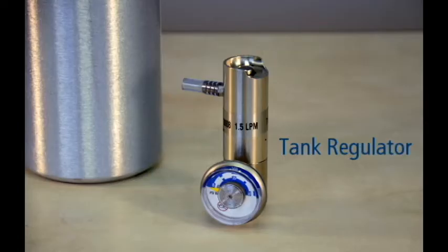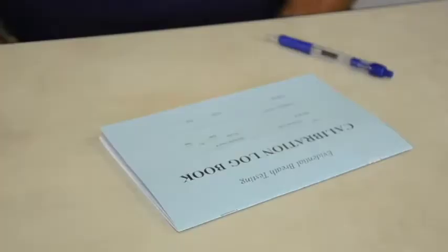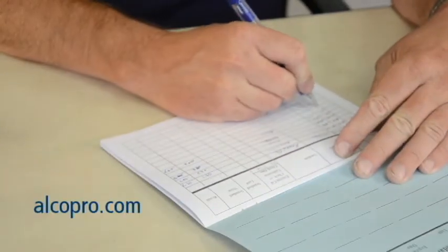You will also need a tank regulator to attach to your dry gas tank. It is a good idea to keep a logbook of accuracy checks and calibrations performed on your device. You can purchase an accuracy check calibration logbook at alkopro.com.